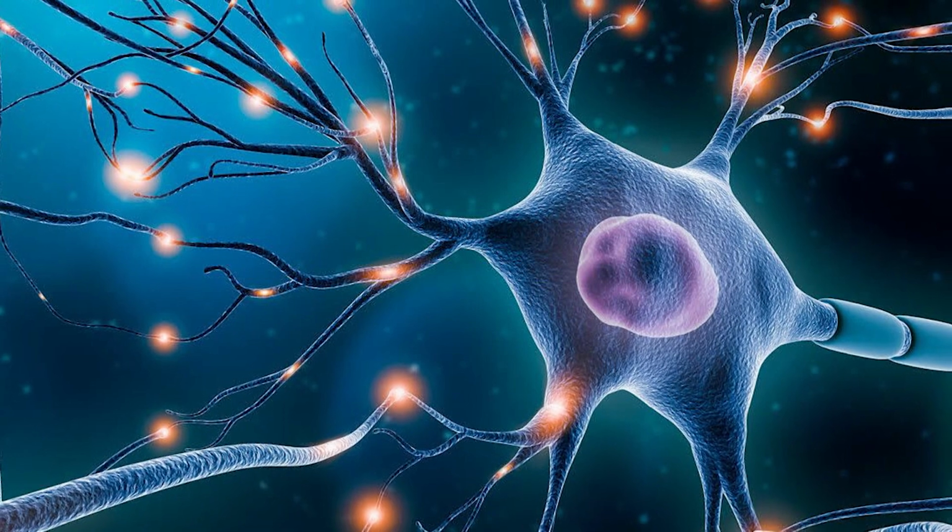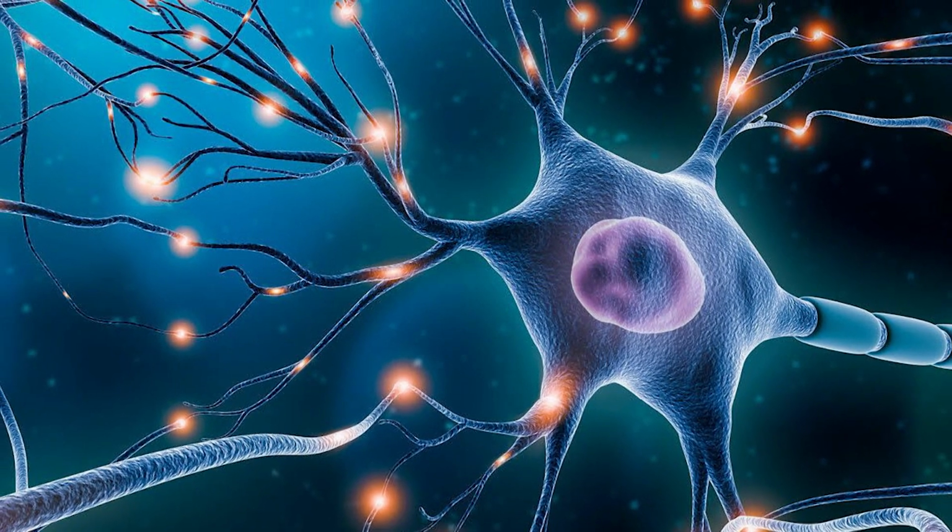In summary, EEG is based on the principle of detecting and recording the electrical signals generated by neurons during their communication. Through the strategic placement of electrodes on the scalp and amplification of the signal, EEG provides valuable insights into brain function, cognitive processes, and neurological disorders. Careful consideration of challenges and accurate interpretation is crucial for meaningful analysis. The different brain wave patterns: alpha, beta, theta, and gamma, and their associated states.